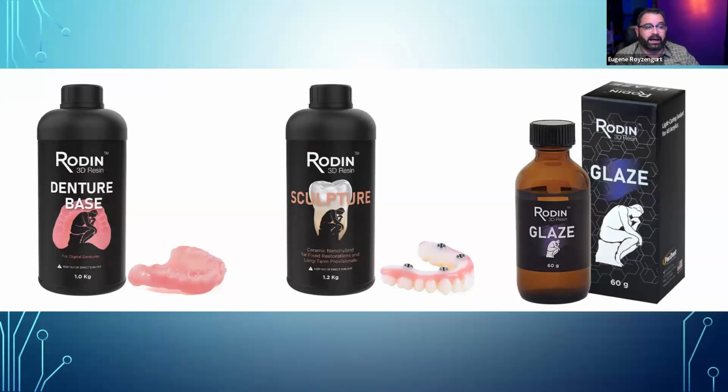Okay, so for what I generally use for my temporary dentures, I do not at this time print permanent dentures, simply because I need to see a long-term study, like a 5-year long-term study, personally, how this stuff behaves intraorally, what the water resorption rates are, what staining is like, and just fracture and everything else. Now, there are lab studies out there definitely showing that it's got some really good results. But for me, I kind of want to see things anecdotally. I want to see other people doing it, and I want to see what it looks like. And if they're happy, then it's fun.